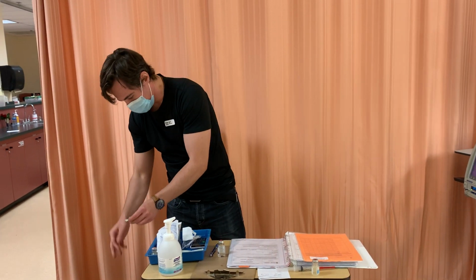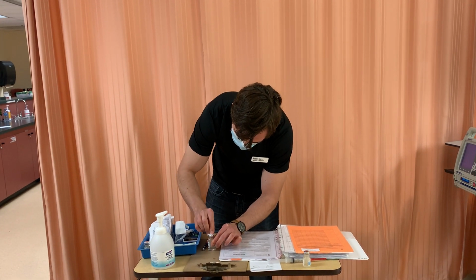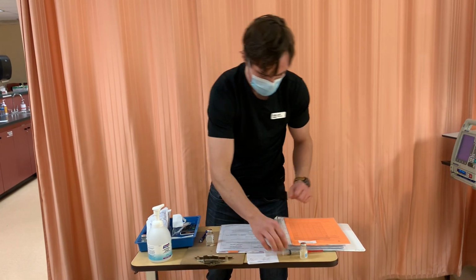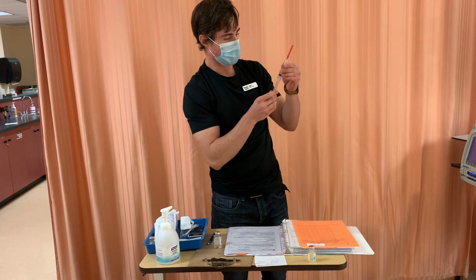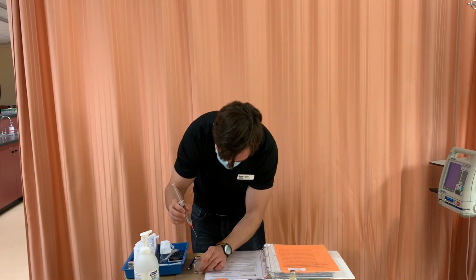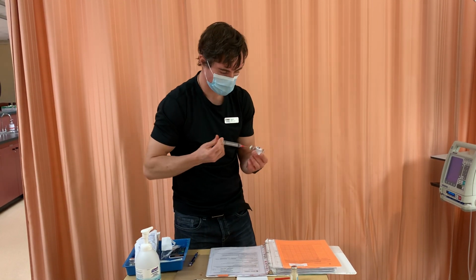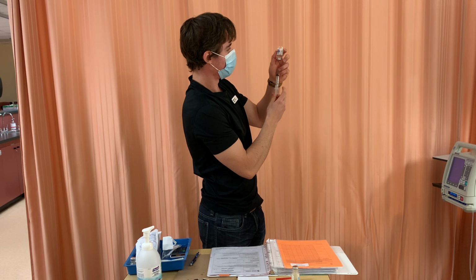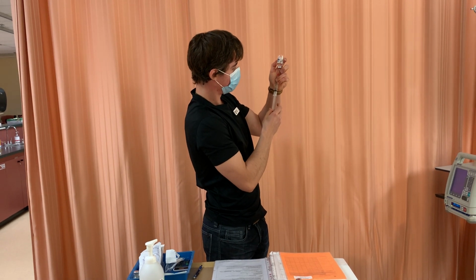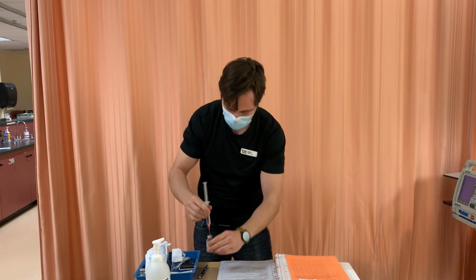So I'm going to swab the top off again for 30 seconds, let it dry for 15. Make sure to maintain sterility. Pull back 10 ml of air. So I'm going to be getting 10 ml of this medication as per my calculation. And I'm going to put another alcohol swab. Pull back a little bit extra.